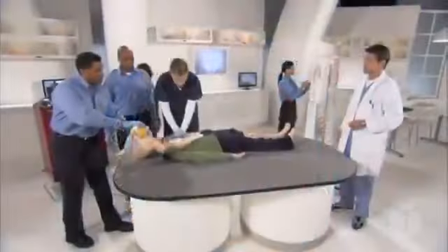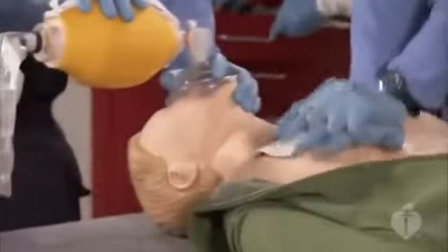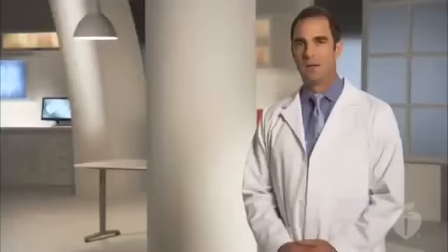The pause should also be used to rotate compressors. Preparing as a team for these pauses and choreographing your movements improves patient care. Remember, AHA wants these pauses in CPR to be 10 seconds or less. Let's return to our case in the training lab to watch how providers incorporate the ACLS survey into a scenario where a patient is suffering from persistent VF.